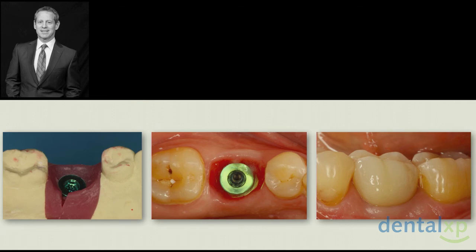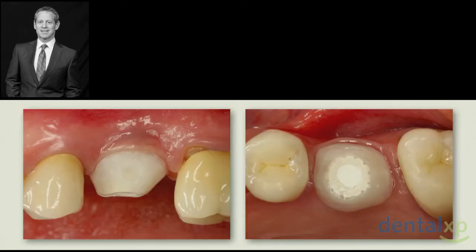And you recognize we have remodeling, but we have bone up against the side of the implants, don't we? And that's the final crown. And here's another one where you can really see it supporting the soft tissue. And there's just a little dimple on the side, which is pretty much what I do now. I don't put the red stripes in them. But a little dimple on the side is enough to just tell you where the buccal aspect is. You can make it shorter, longer, doesn't really matter as long as it's comfortable to the patient. Highly polished and steamed on the internal aspect.